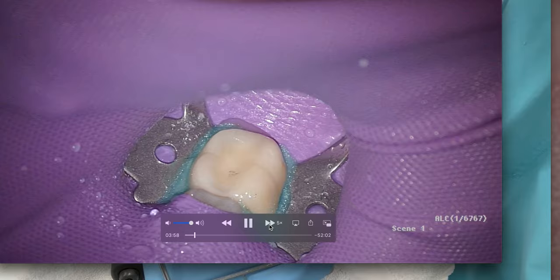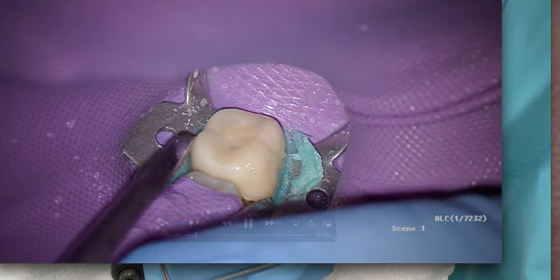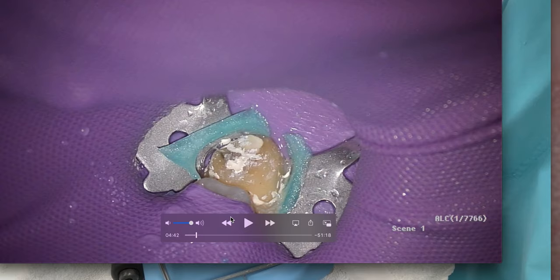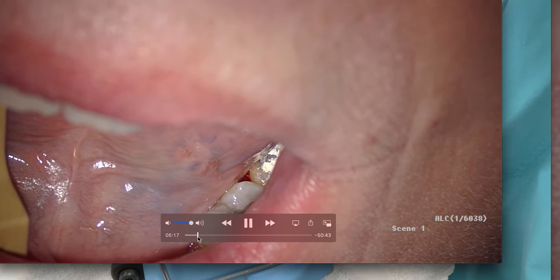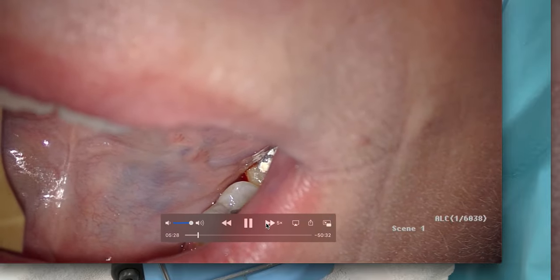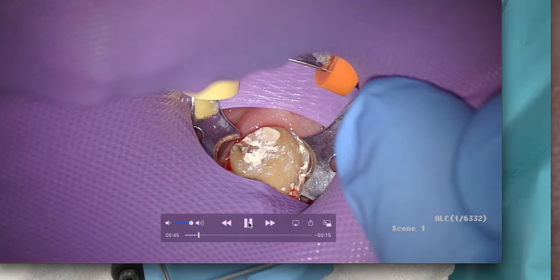I tried using hemostats, thinking I could keep the rubber dam frame on while taking the crown off — but no, it all comes flying off. If you're still watching, here's the secret of what not to do: you'll watch the clamp go flying too. After that, I used the 2a clamp. It's small enough to grab just sufficient tooth structure on the remaining preparation, and then we use Opal Dam again to fill in any gaps.